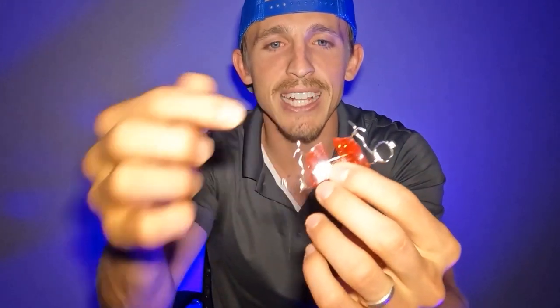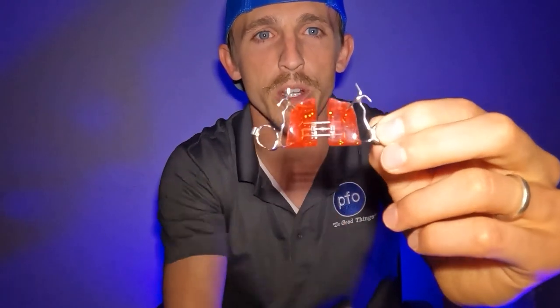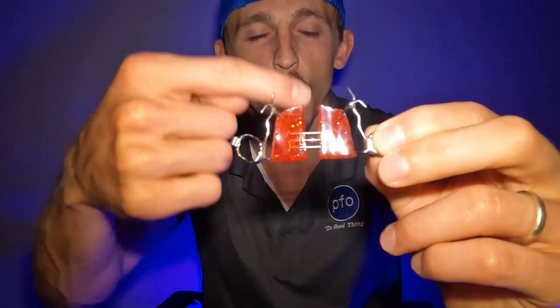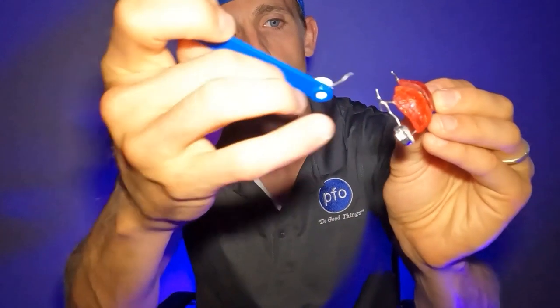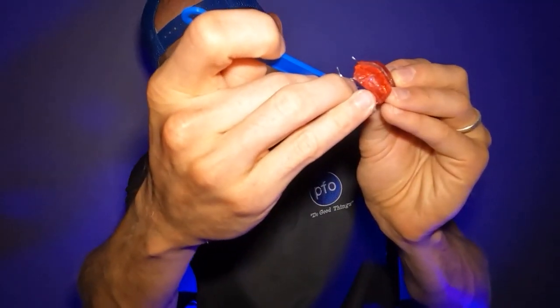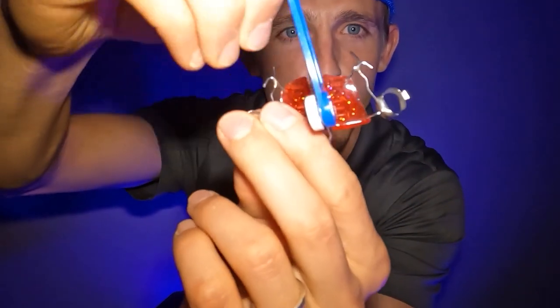Part of the expander has these other metal components that rest against your teeth or on your teeth. Then there's this middle portion — this is the screw. This screw has multiple different holes, and what you do is you take an expander key like this and you stick that into these little holes. You follow the arrow, which is pointing backwards, and you turn backwards — that's what forces the expander apart. It makes the expander widen and can expand or change both the palatal bone and move the teeth apart.